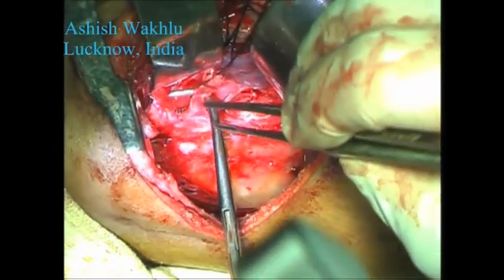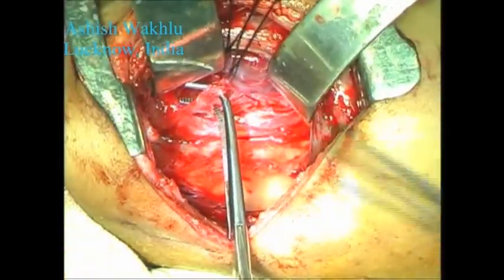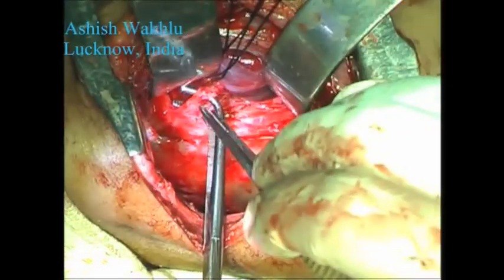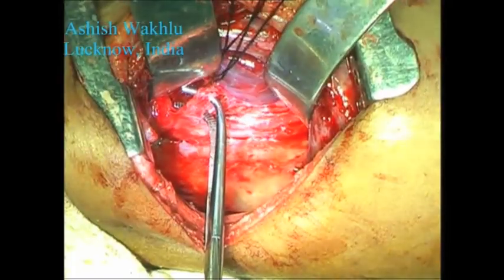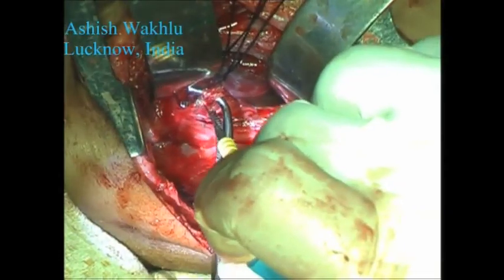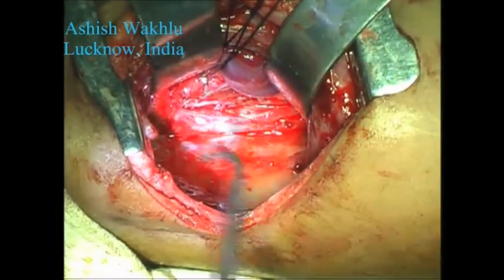The trachea lies just underneath the tissue which is being held up in the Rumel's artery forceps, and there is an extensive degree of fibrosis in this region, perhaps from an inflammatory origin.